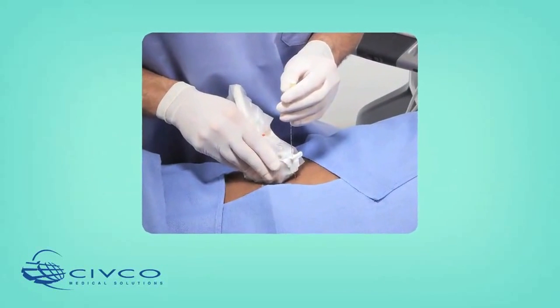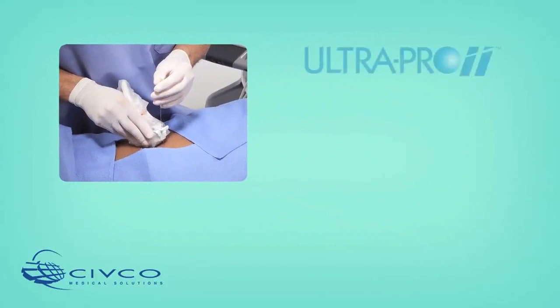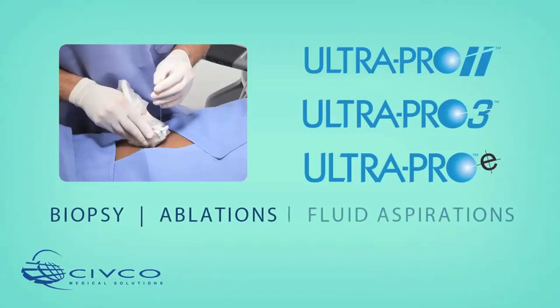Civco's UltraPro needle guidance systems provide in-plane solutions for safe, accurate and efficient needle guidance. The UltraPro 2, UltraPro 3 and UltraPro E needle guides are suitable for a variety of applications such as biopsy, ablations and fluid aspirations.